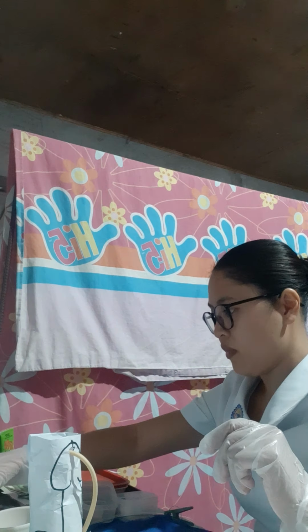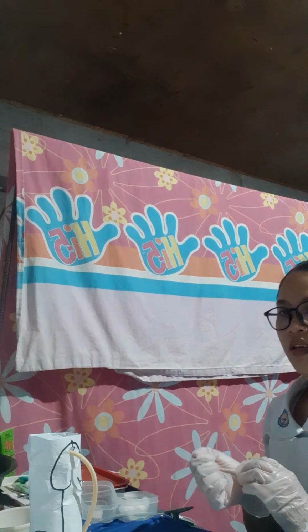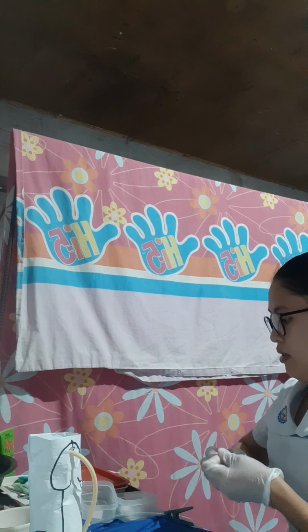Next, remove gloves and additional PPE if used, then perform hand hygiene.